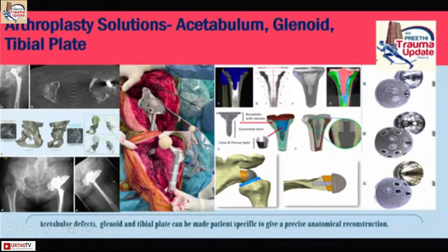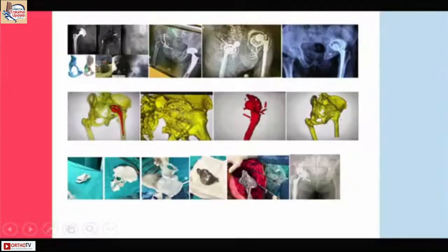Not only that, you can create trabecular structure there and establish osteointegration. Look at this case — a very bad fourth-stage revision where the surgeon didn't know what to do. We had to do a segmentation and create an acetabular component, and that acetabular component helped give an anatomical outcome to the patient.